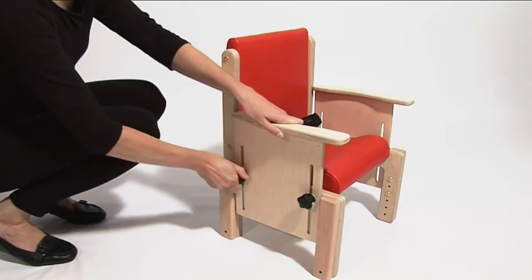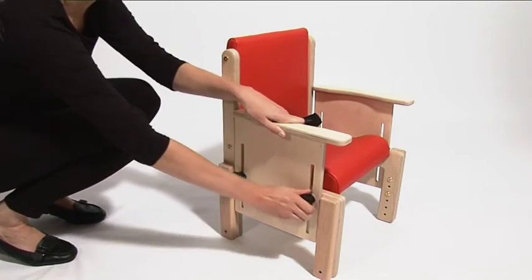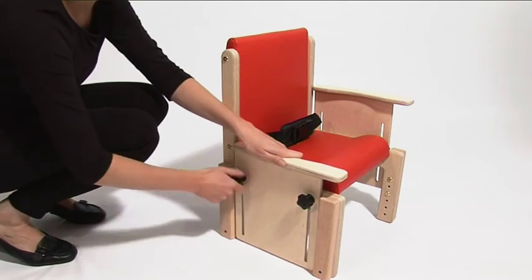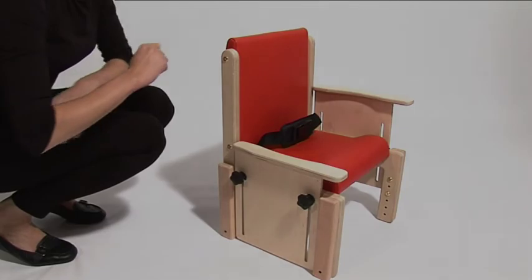To adjust the height of the armrest, loosen the hand wheels, slide the armrest to the desired position and then tighten the hand wheels.